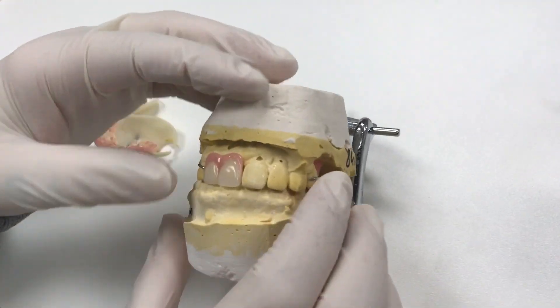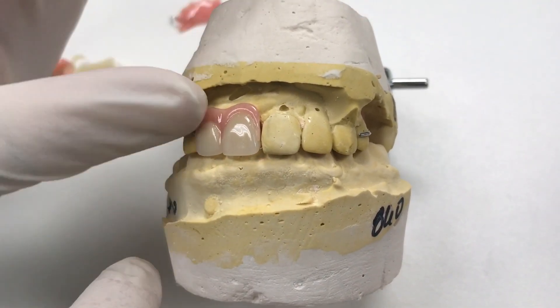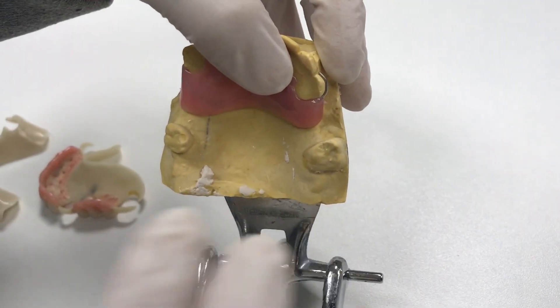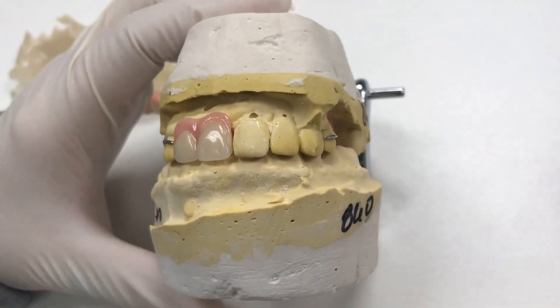This one's just another acrylic partial, replacing two anterior teeth. They are getting immediate extractions and implants placed, so they just wanted to replace the anterior teeth. Even though they're missing posteriors, they're going to use it very temporarily while they're healing — just for aesthetics only.